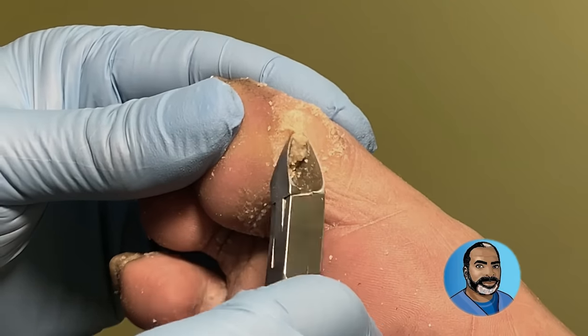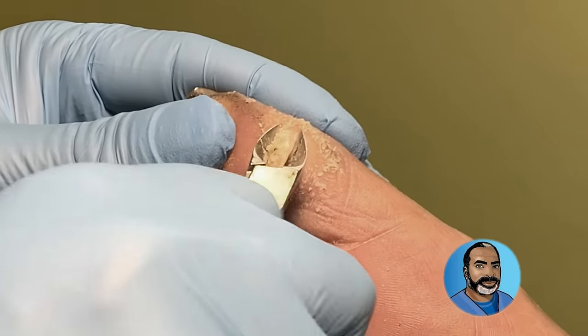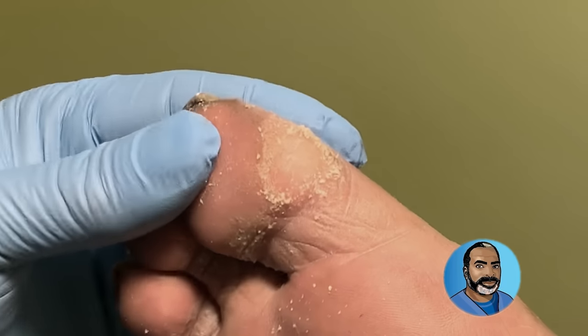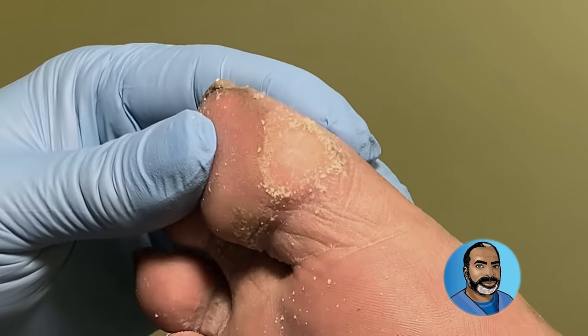Tissue nippers are used to remove that hard callus and other structures of the skin, and structures deeper than the skin, but not toenails or fingernails and not bone.